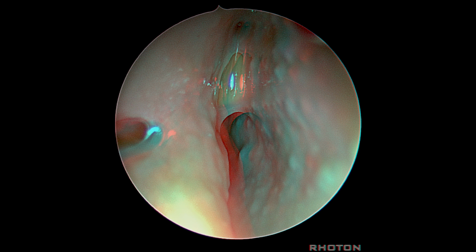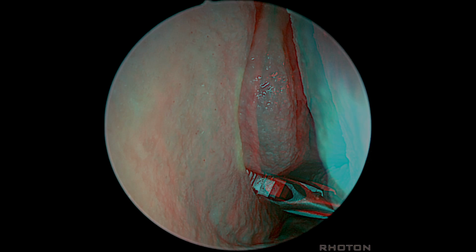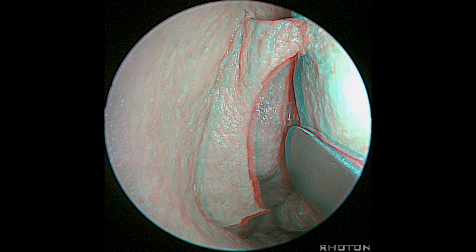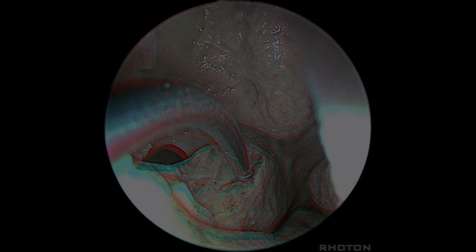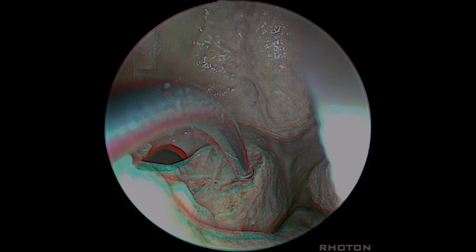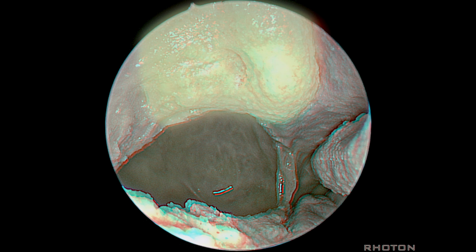We see the drainage of the anterior ethmoidals and the frontal sinus, and then we can divide that uncinate process, pull it over laterally, and we see how big these ethmoid air cells are. You can enlarge the maxillary duct opening out of the middle meatus. And here's a large opening into the maxillary sinus. This is the anterior ethmoidal air cell.